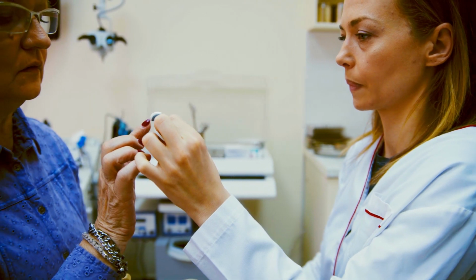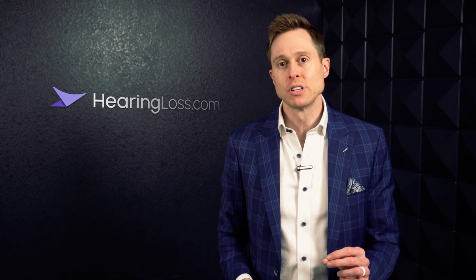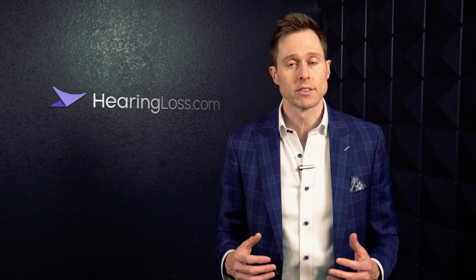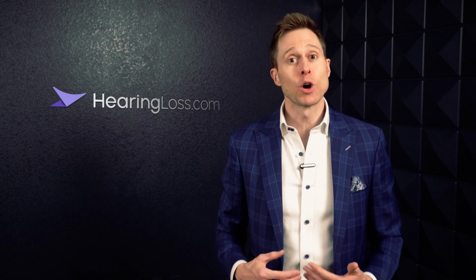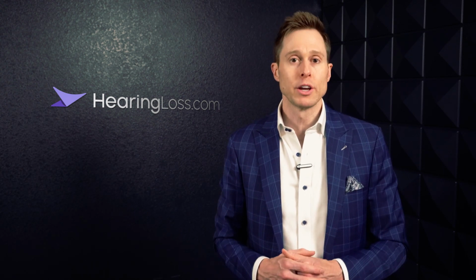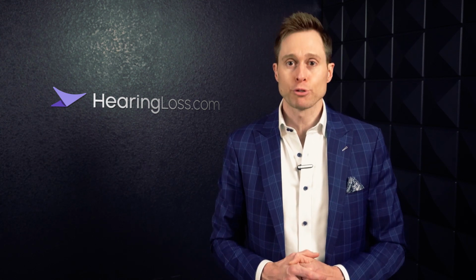If you're like the majority of individuals with hearing loss, prescription hearing aids are your best option due to their overall level of customization when it comes to treating your hearing loss. And since you purchase them from a local hearing care professional, you will have ongoing local support if your hearing changes or if your hearing aids require repairs. So if you have difficulty hearing and are considering going the prescription hearing aid route, make sure that you schedule an appointment with a local hearing care professional to get your hearing evaluated and to discuss your prescription hearing aid treatment options.